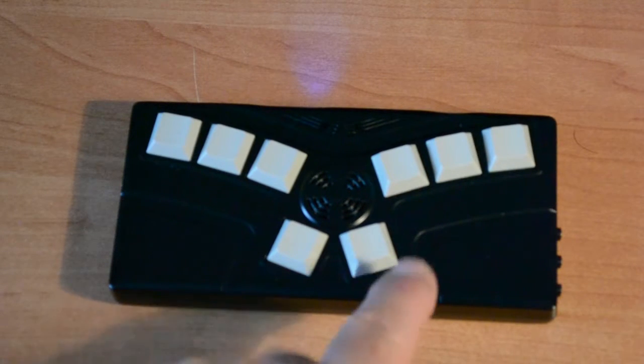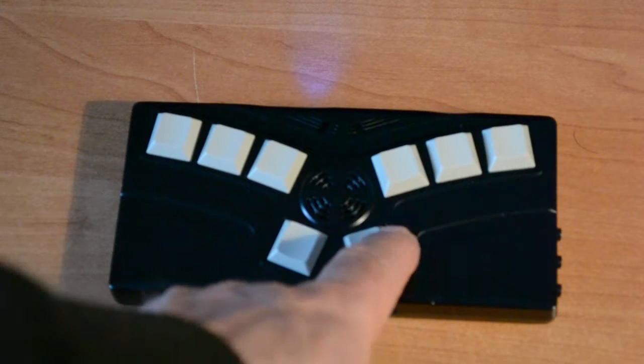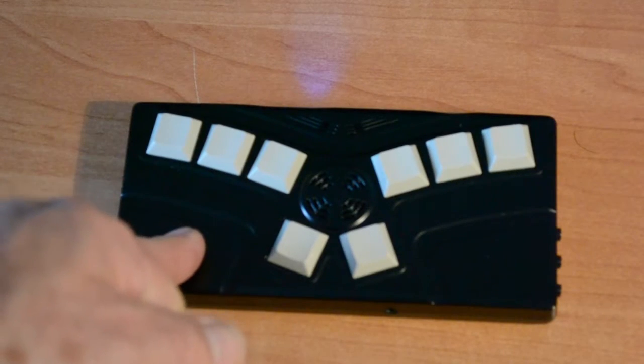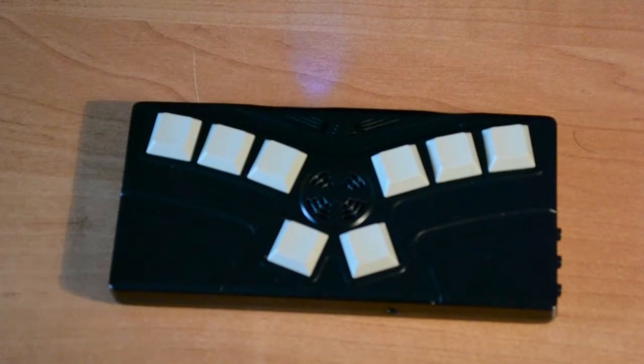We have several of them. We can go to the right or to the left, pressing the left or right key to select the connection type. We can connect it as a keyboard, as a sound, or keyboard and sound. So now we will be able to control the computer from the IBAI as an external keyboard, and at the same time we will get sound from the computer.